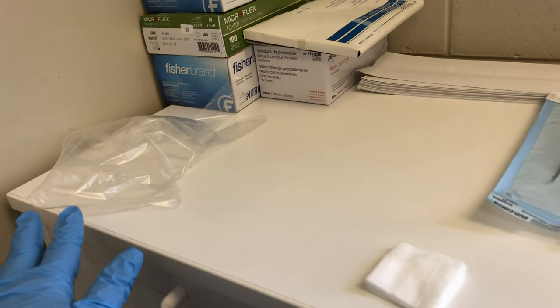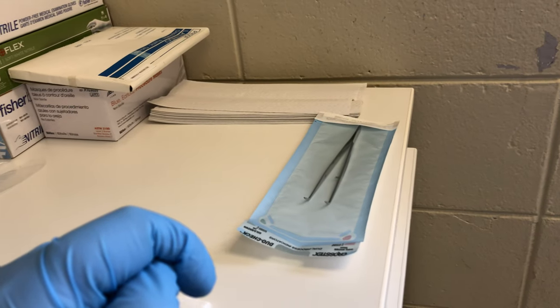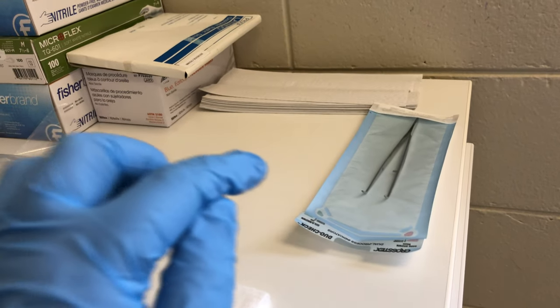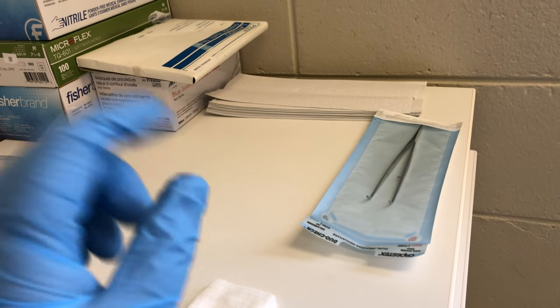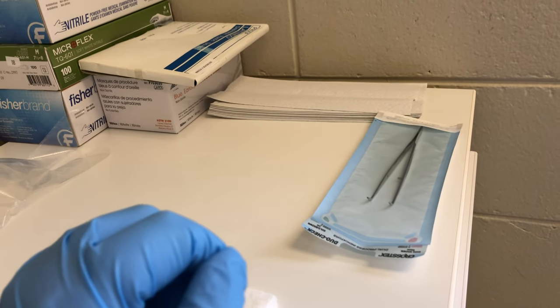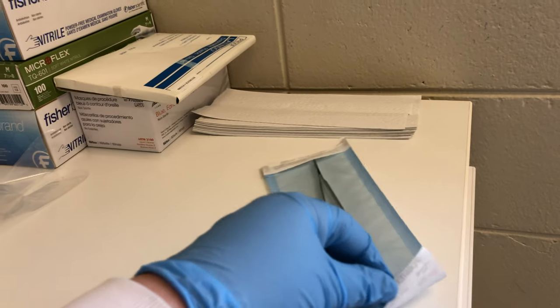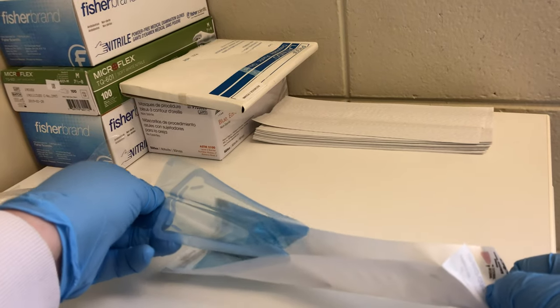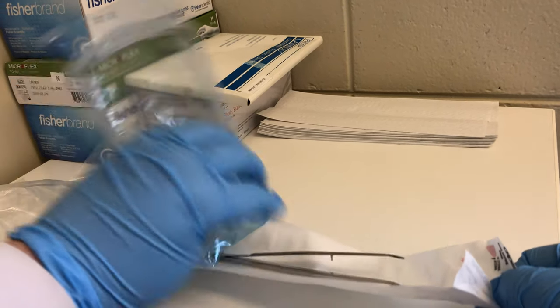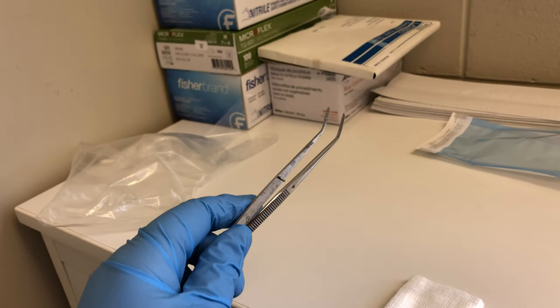If your office doesn't purchase overgloves due to the added cost, using a cotton pliers is a very common technique. It's also great for when you're sorting through bins looking for small items like a wedge or a composite capsule. This cotton pliers is not used in the patient's mouth — it is separate from the cotton pliers used by the doctor, so the assistant will have their own.